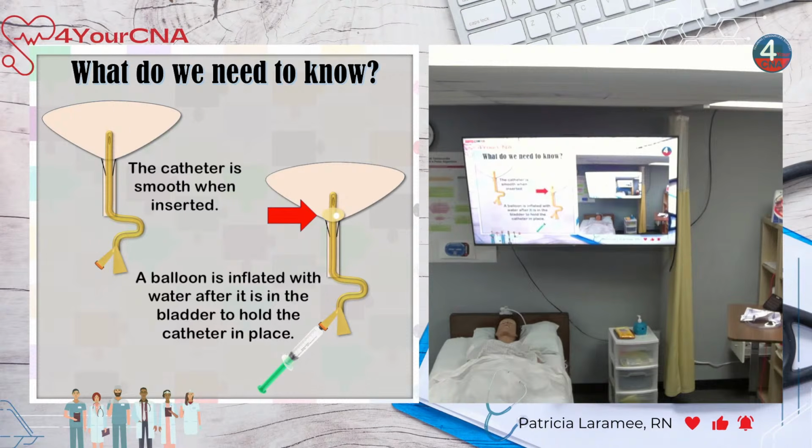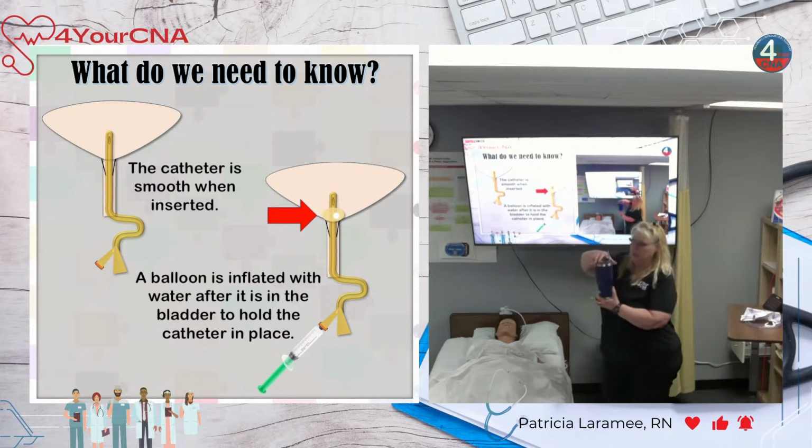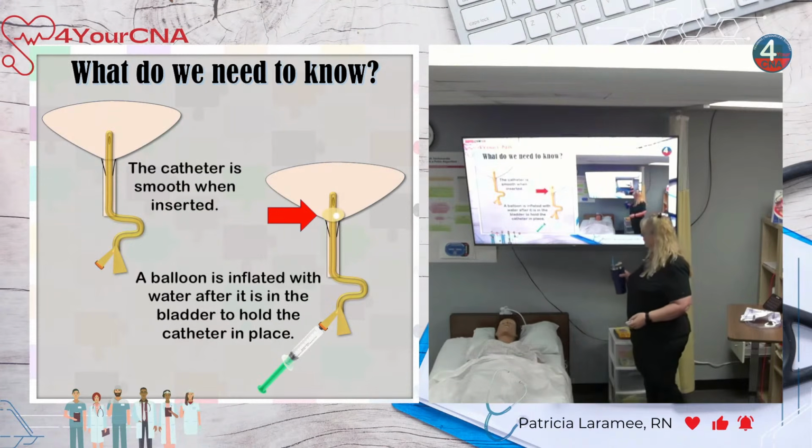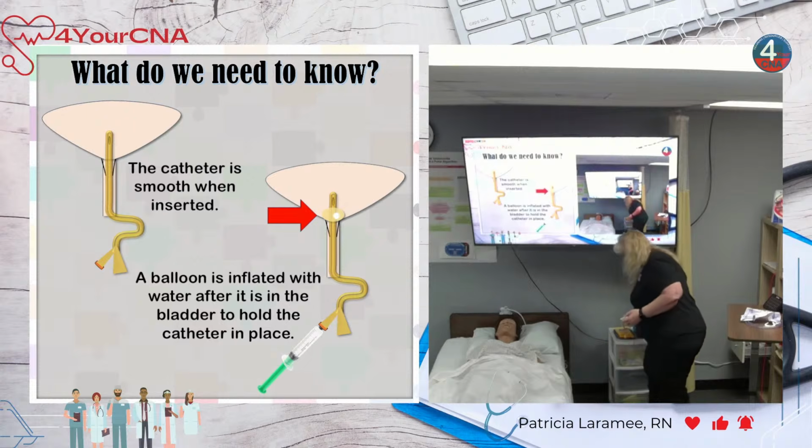A straw lets liquid go from one end through the other. That's all a straw does. That's all this does. Lets liquid go from one end to the other. Why is it showing it with like two little at the bottom? Okay, we're going to talk about that.